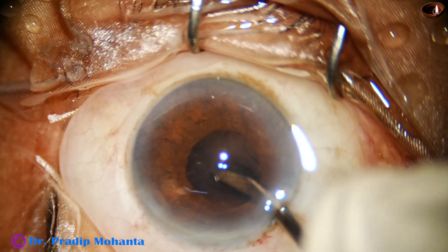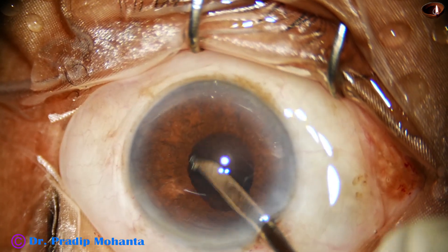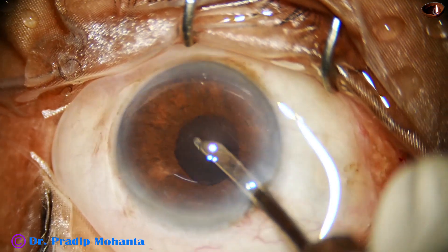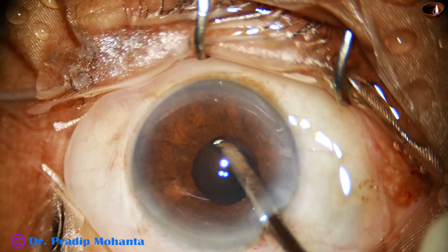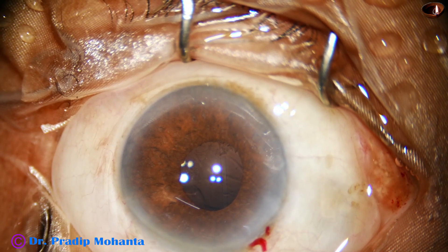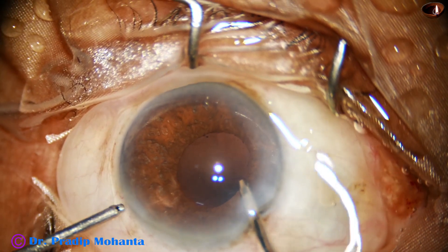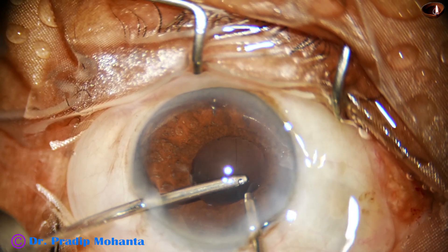Now I use a Simcoe and then bimanual irrigation aspiration to remove the cortex. B-Octa is a new device invented by Dr. Subin Bhattacharji, the same person who invented B-hex long ago. We are using B-hex and are very happy with it. We are really proud of Dr. Subin Bhattacharji because in India it would have been a burden on ophthalmologists if we had to use devices like the malyugin ring, which is very costly for our patients.